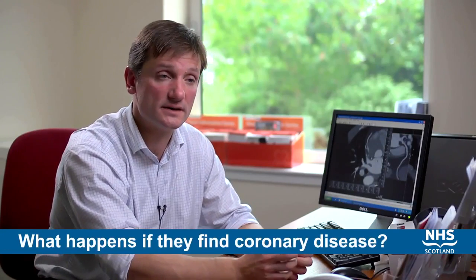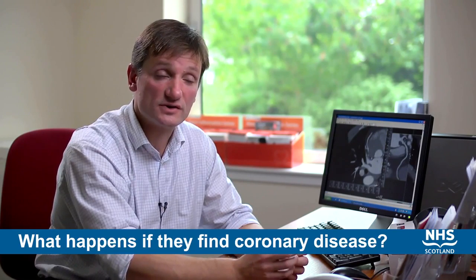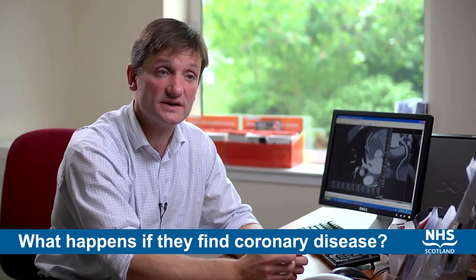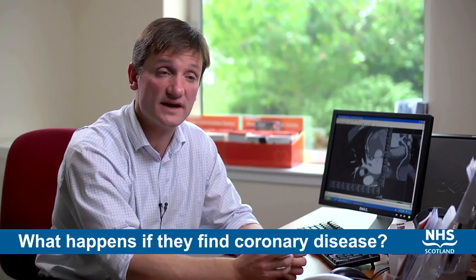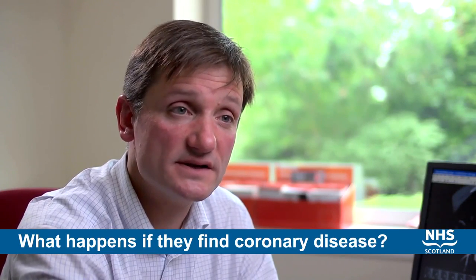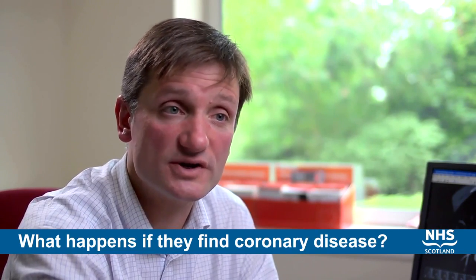If they find a narrowing or blockage in the coronary artery, we have options. One option is to continue or to increase medication to treat the angina. Commonly, if we find a narrowed artery or arteries, we have the option of following on and treating the narrowing directly using the angioplasty and stenting procedure. Occasionally, we may identify more severe or complex narrowings, and in that situation, it is appropriate to stop and perhaps plan further treatment, which may involve coronary artery bypass surgery.